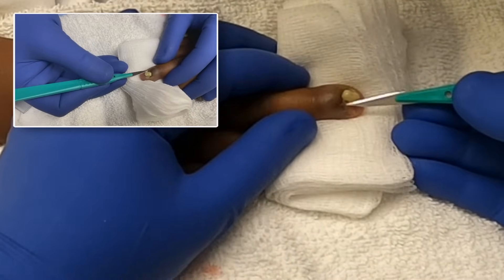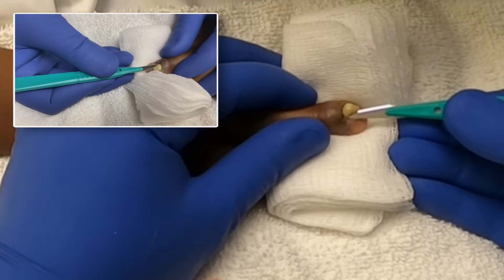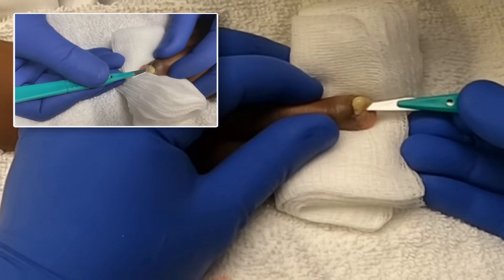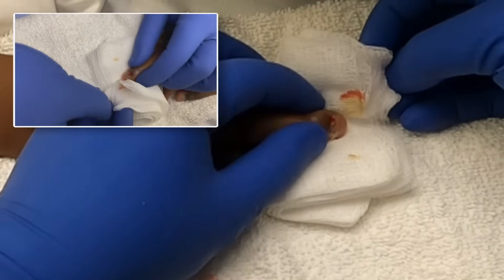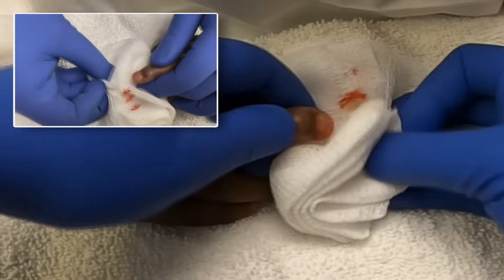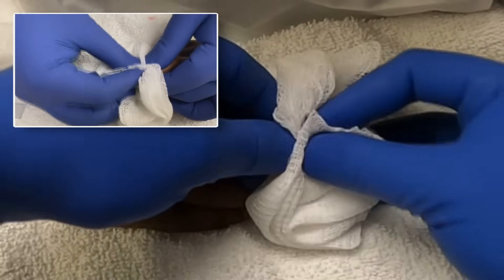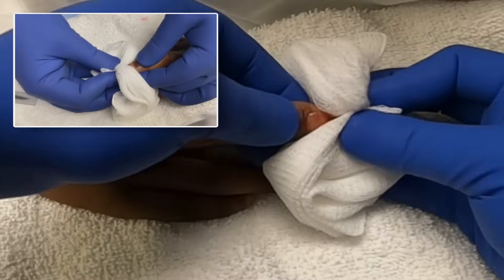Give it a little bit farther. It's almost done — they're doing it right now. After we got the local block done the patient didn't really feel anything. It's all done — you can just manually express whatever's left after that with compression.